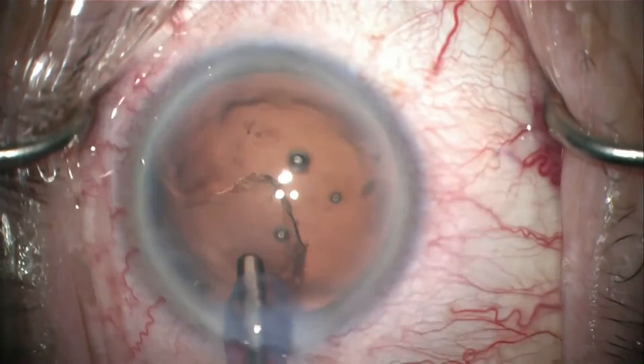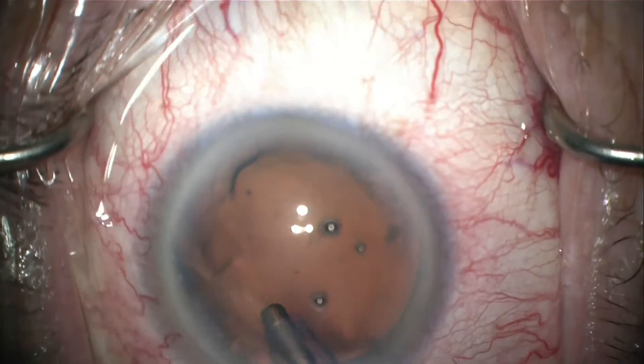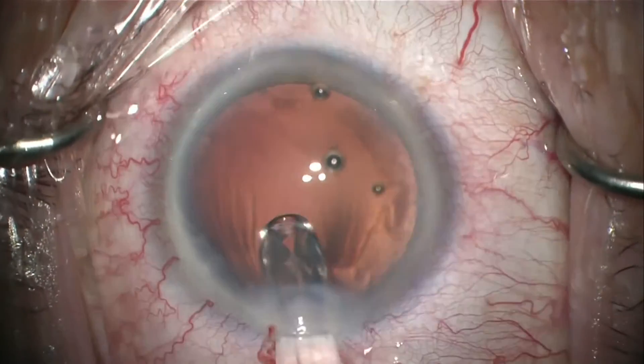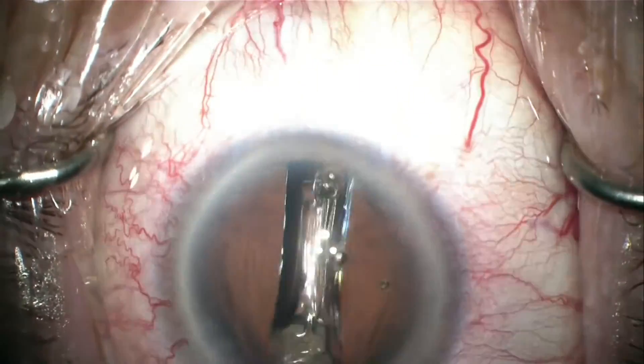Here I follow with the automated I/A irrigation-aspiration mode to remove some of the cortex. Finally, after viscoelastic is placed, I inject a one-piece acrylic Tecnis monofocal lens.